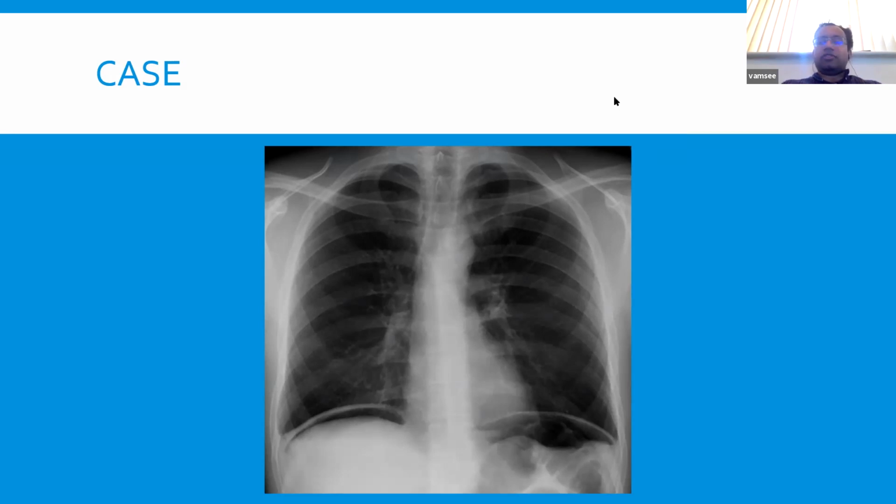I may have lost Andrew, but that's fine. Basically, what I was getting at is if you ever see pneumoperitoneum, exactly as Andrew mentioned, most likely you're suspecting GI perforation. Unless this patient has known GI surgery in the very recent past, you would get a surgical opinion, and they will be heading towards a laparoscopy or some other surgical intervention to find out why. You could even look for further imaging, to identify that with CT. But that's just something for extra brownie points to mention.